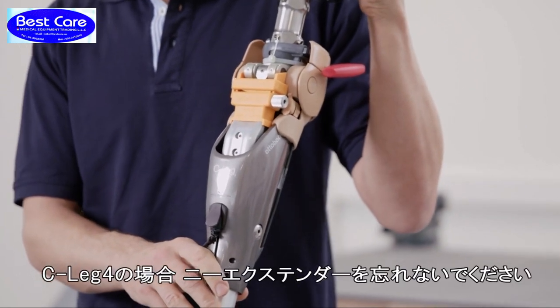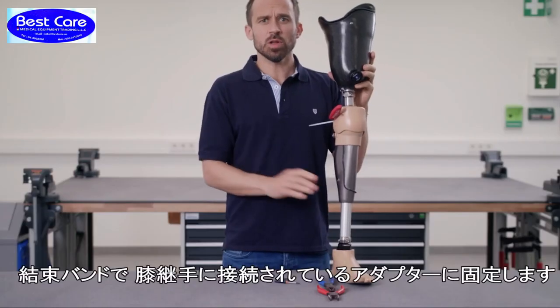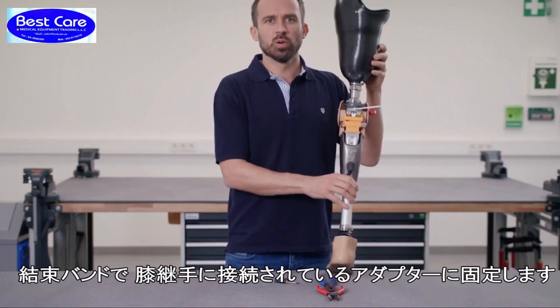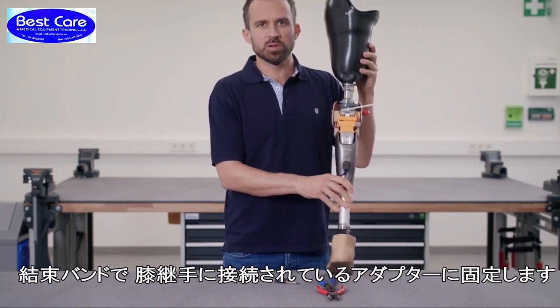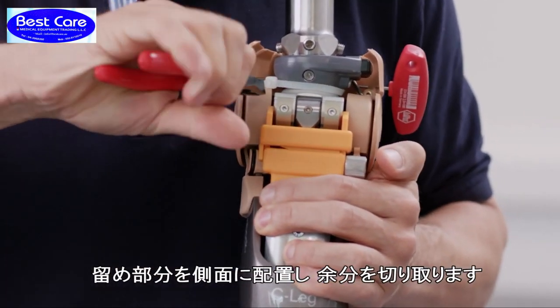Just another reminder: please use the knee extender for the C-Leg 4 here. Now use the cable tie to pull the metal bracket firmly against the adapter over the knee joint. It is best to close the cable tie to the side and trim it.